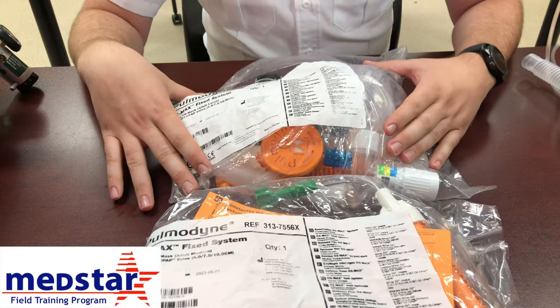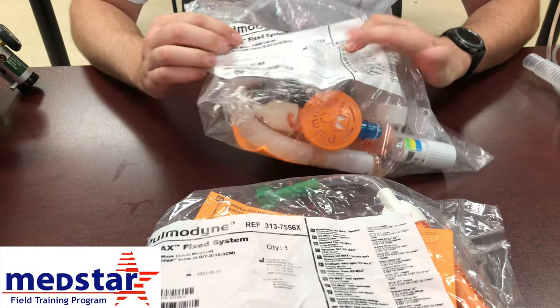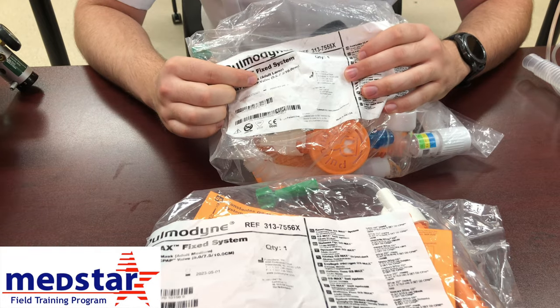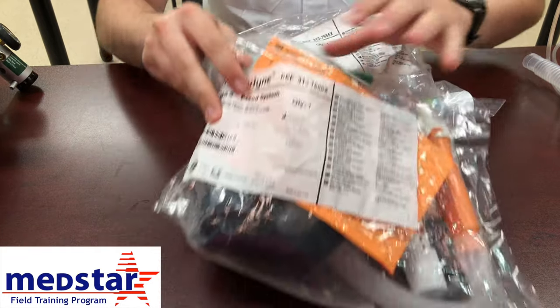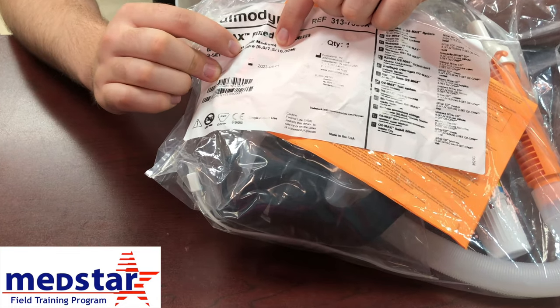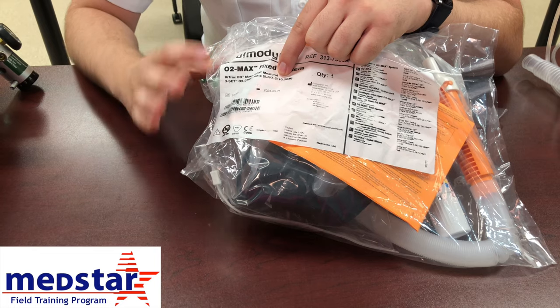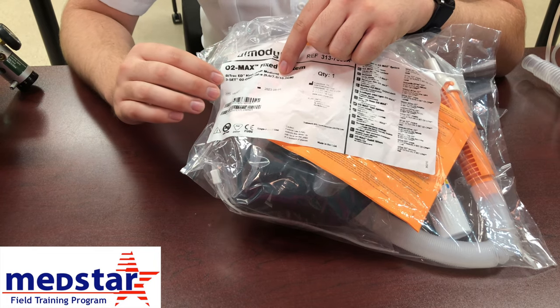These are the CPAPs that we carry. There are two different sizes. To find the size, look on the front in white — it will say either 'adult large' or 'adult medium' right there on the front of the package. The only difference in the actual contents of the package is the size of the mask that goes on the patient's face.